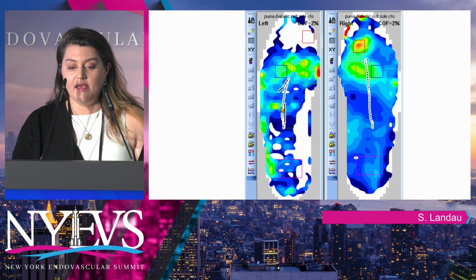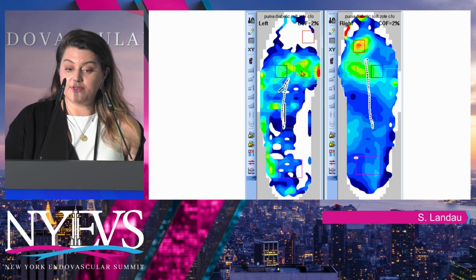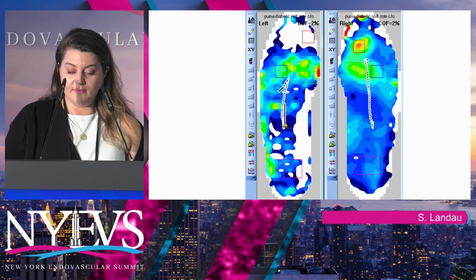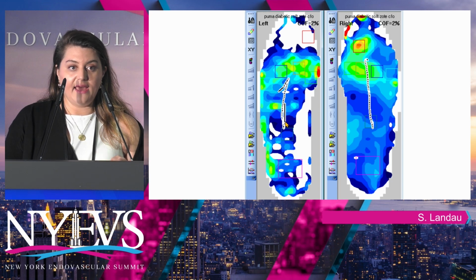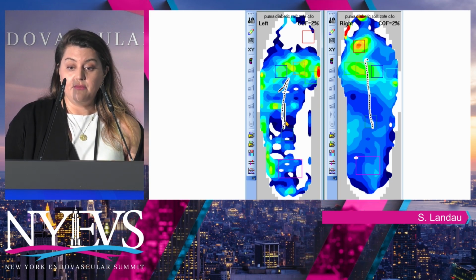But you can see that it actually adequately and greatly reduced the peak pressures on his left foot. And in addition to that, in my cast and prescription, it neutralized his proximal deformities that were adding more stress and more demand on that area.